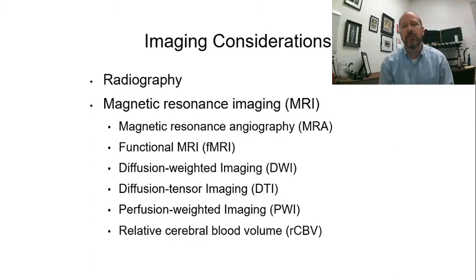When we're trying to image within the central nervous system, radiography is not going to be our go-to thing. MRI is going to be our best option for imaging most everything inside of the central nervous system because of its increased ability to detect disease, to evaluate for tumors, stroke, cranial tumors, any kind of infection, multiple sclerosis, and it can also depict expansion and compression of the spinal cord as well. It has a limited role for evaluating trauma, so that largely will still be done by CT.